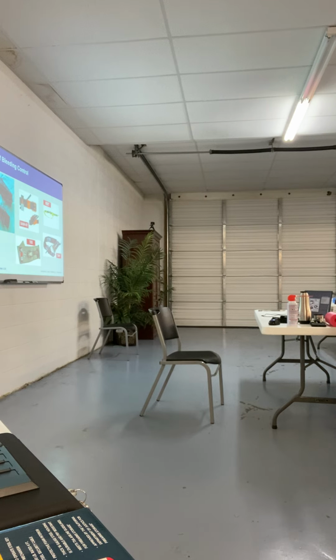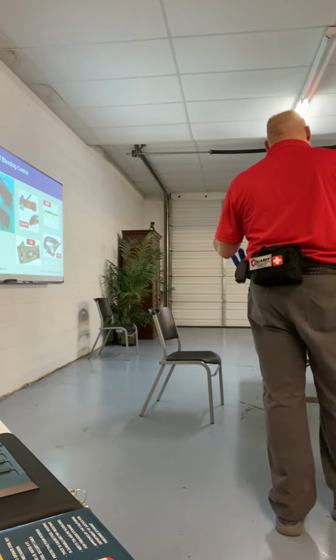So look, right before the red tip, there's going to be that same thing, right? A printing of Cat 7 tourniquet. Here's all the patent numbers and the whole nine. So if you don't have that, it's not legitimate.